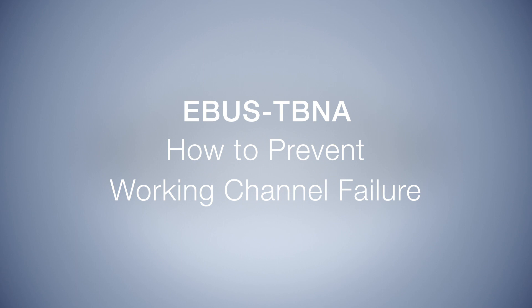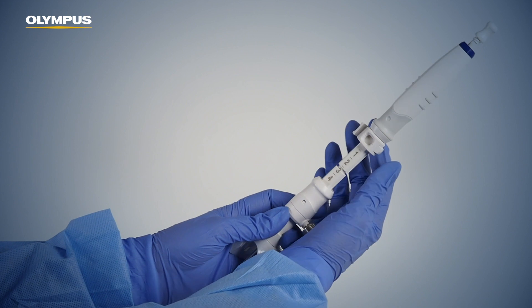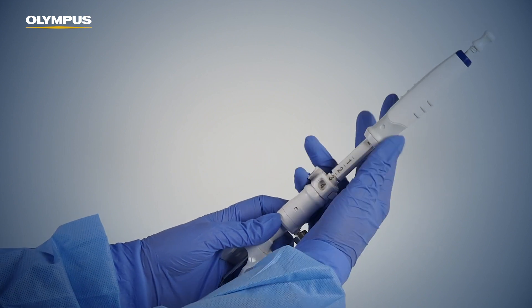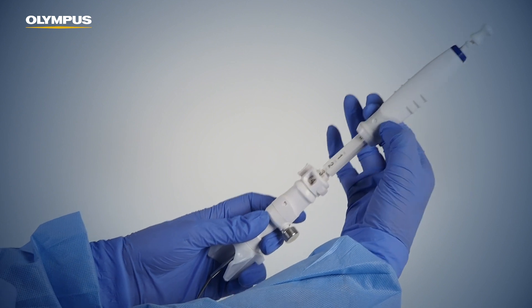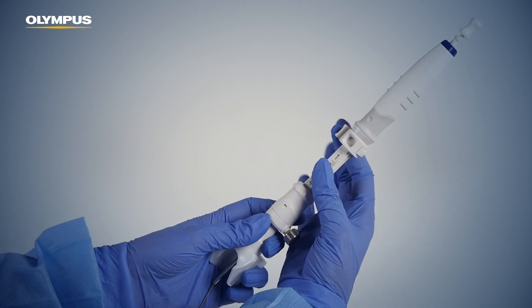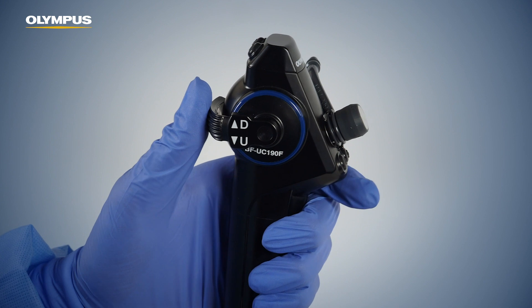How to prevent working channel failure. Confirm that the needle is fully retracted and that the needle is securely locked with the needle adjuster lever. During insertion of the needle, always keep the endoscope in the neutral straight position. Do not use angulation during insertion.